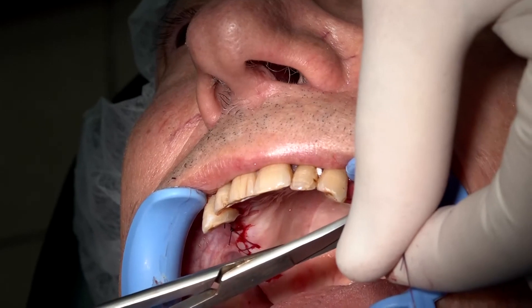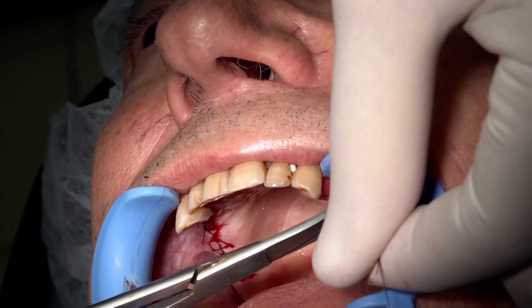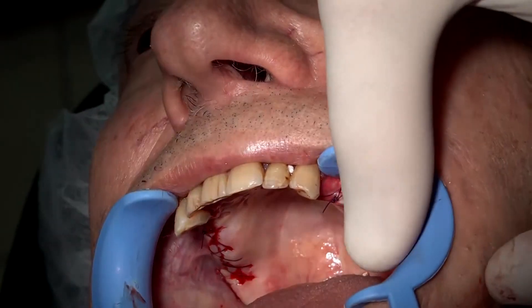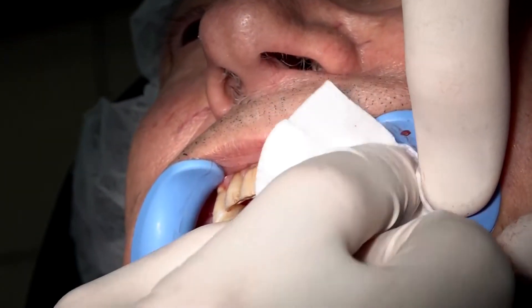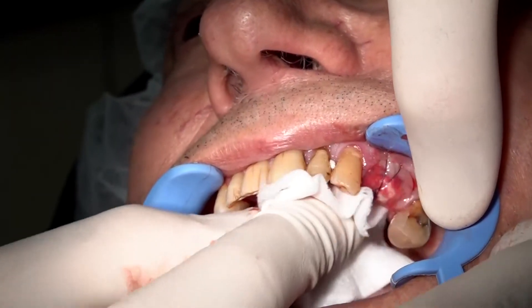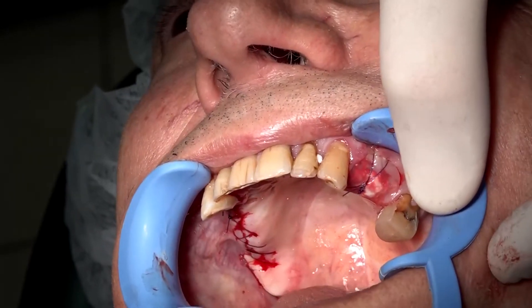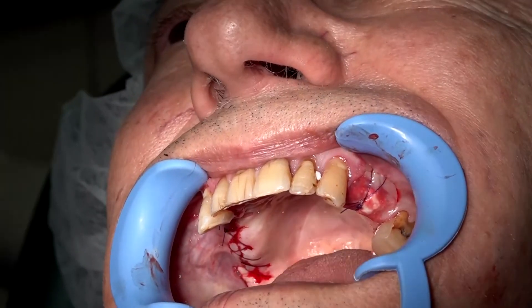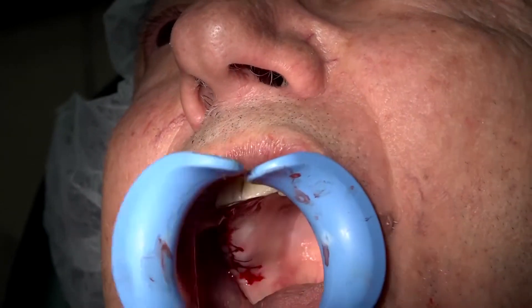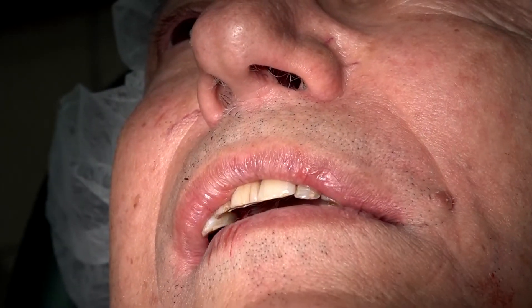That's all. Now, of course, we instruct the patient not to play with the area and to do mouth rinse — not with salt water, because salt water will accelerate the resorption. However, with chlorhexidine gluconate, we have absolutely no problem to make a mouth rinse.